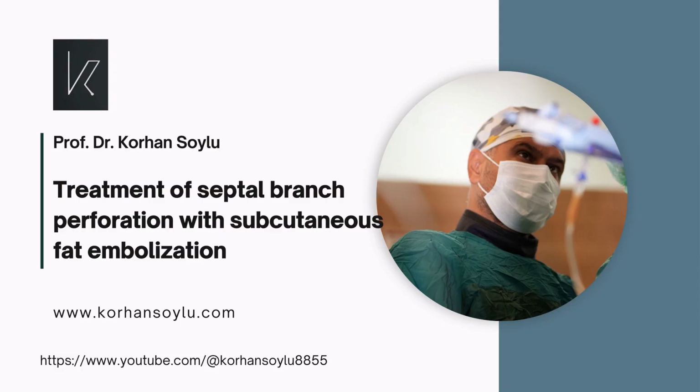Today we will try to show how we treat septal branch perforation that occurs during the retrograde CTO procedure with subcutaneous fat embolization.